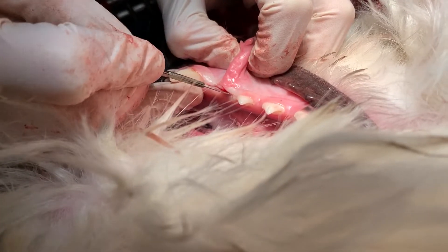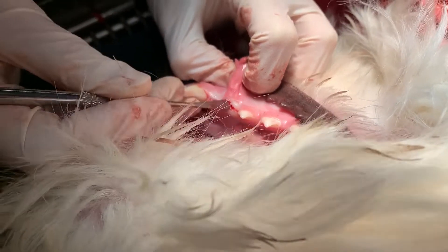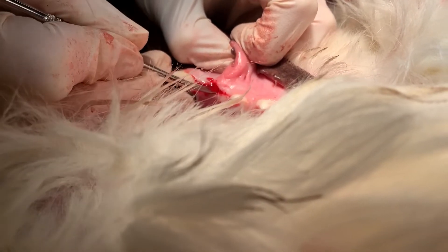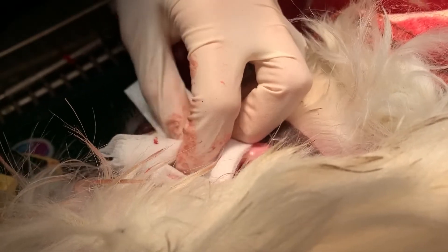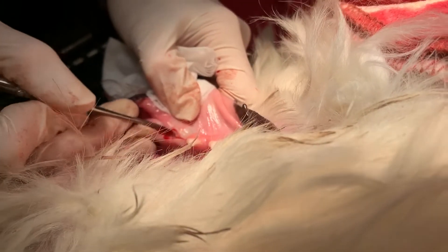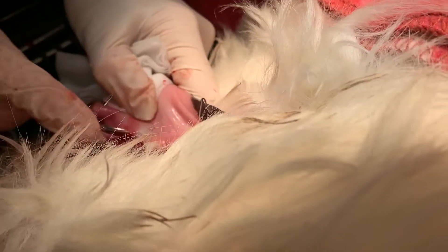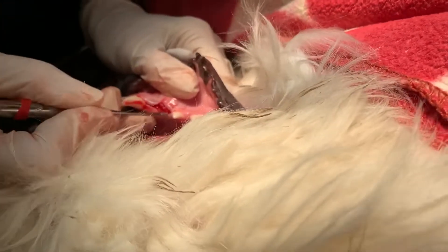Now we're on to the other side. You can see this side does not have quite the large amount of pocketing as the other. Nonetheless, he had both first premolars on the mandible unerupted — we call those 305 and 405. Now we're working on 405, which is on the right side of the mouth. Same thing, they were starting to form a cyst. While it wasn't as large as the other side, we needed to address both at the same time. I'm going to use the periosteal elevator to pull the gingiva back and expose the area, then do the same procedure: debriding the tissue, removing the unerupted tooth, and making sure all of that cystic material is out of there. We'll bring the gingiva up and close it to protect the wound.